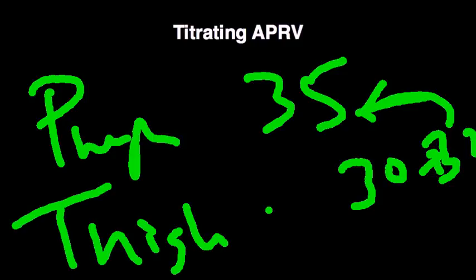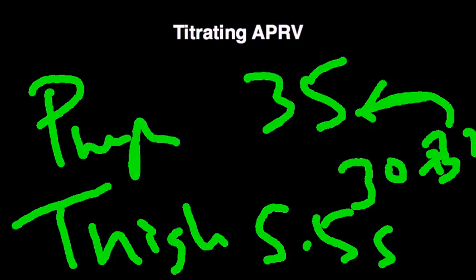If you started off with a default setting of 5.5 seconds, you can go up to a value of 6 seconds. This optimizes the amount of time the lungs are recruited and expanded to allow and facilitate oxygenation.